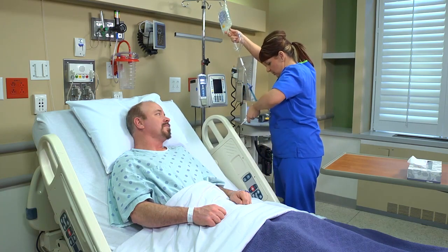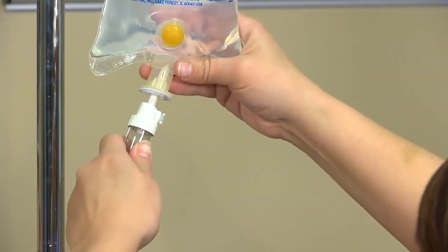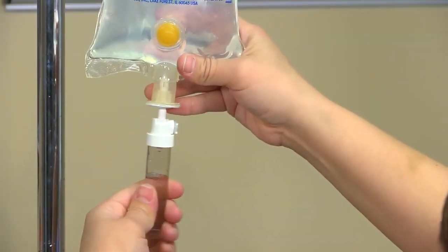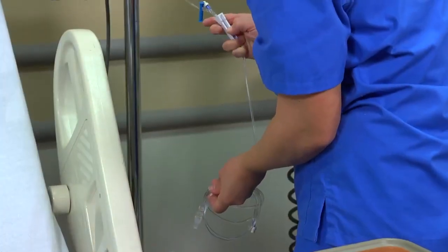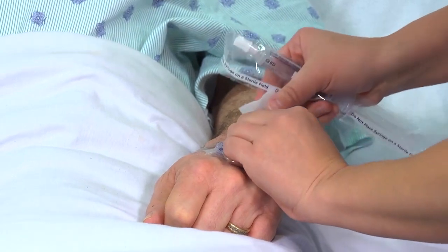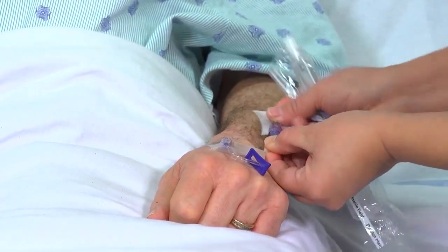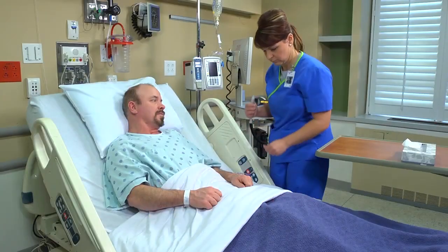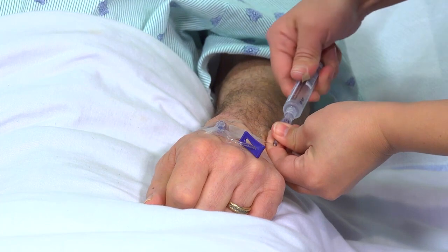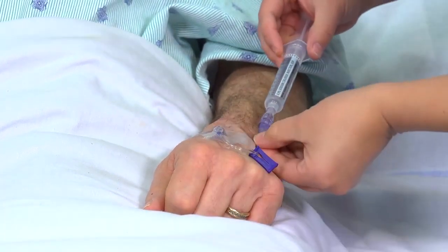Insert the spiked end of the pump tubing into the IV fluid bag. Now prime the tubing. Squeeze and fill the drip chamber to force the air out of the tubing. Then open the drip regulator to allow the tubing to fill with fluid. If the patient doesn't have fluids hanging, flush the saline lock with 2 to 3 milliliters of normal saline.